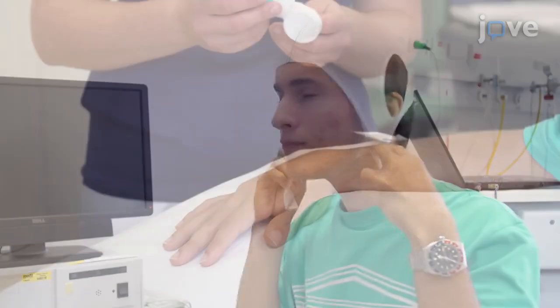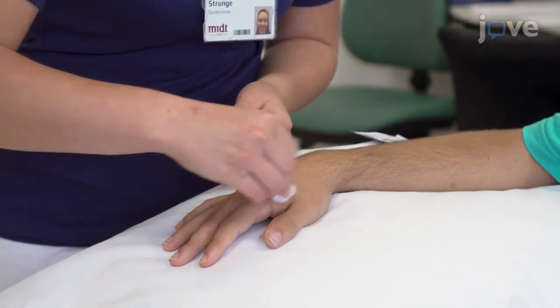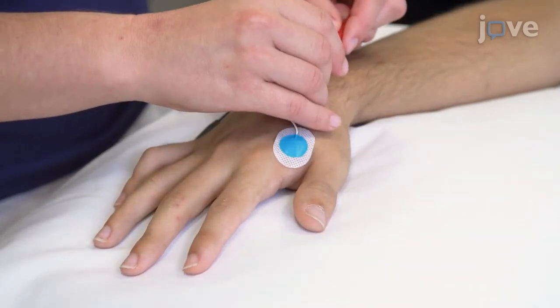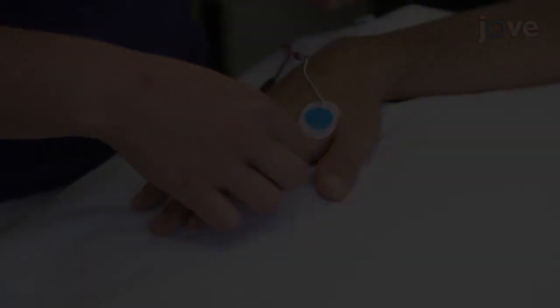Then ask the subject to wear a swimming cap. When the subject is ready, clean the hand of the subject contralateral to the hemisphere to be studied. Then place the active recording electrode over the first dorsal interosseous, or FDI, muscle, and the reference electrode on the second metacarpal cortex.